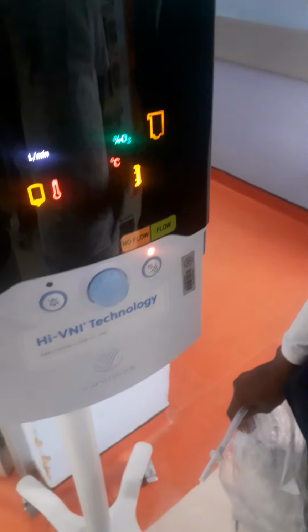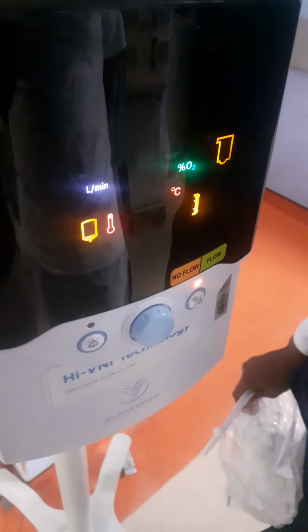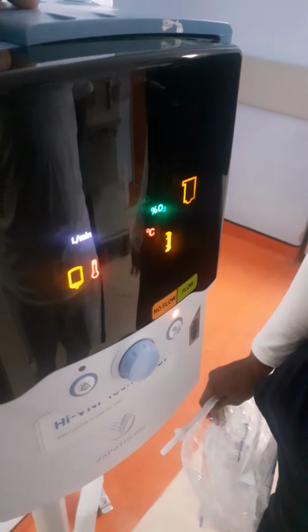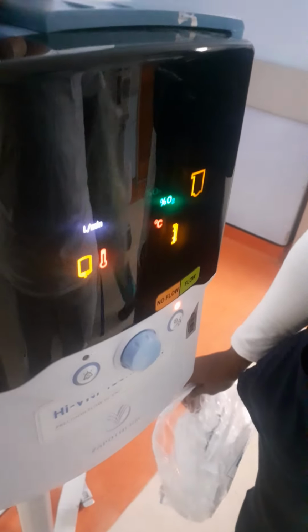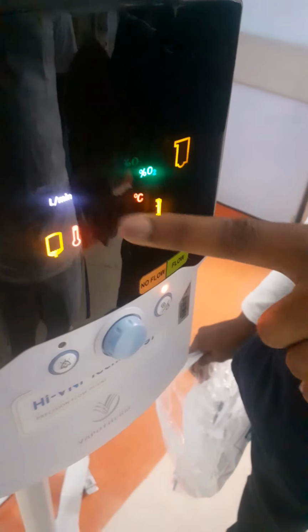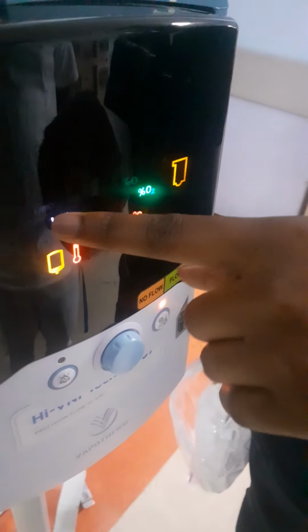Here in adults, we don't use it because the actual body weight, how will we get it? And the flow only reaches 40. So if you weigh about 90, how are we going to give you the flow? Usually, personally, the lowest flow is 5, and that's what I start on.